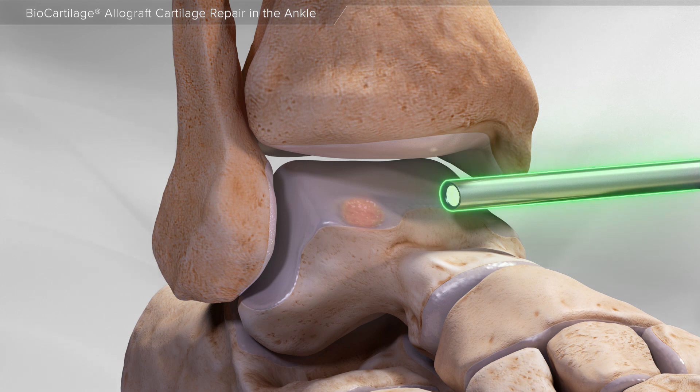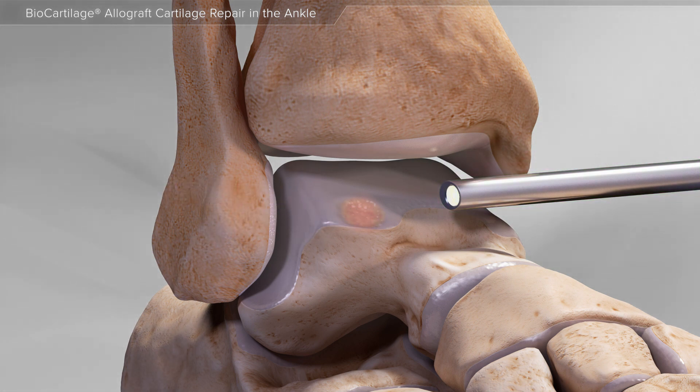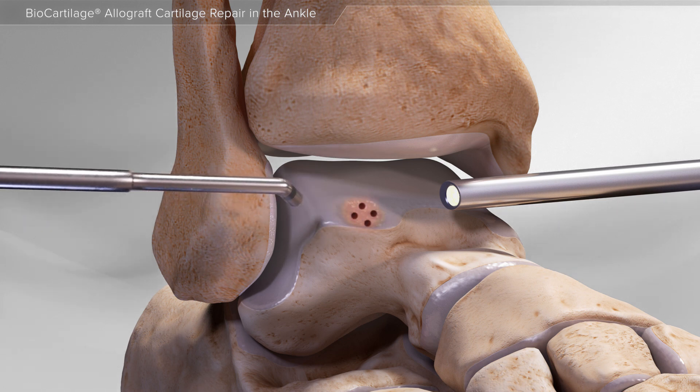First, a camera is inserted into the ankle joint for visualization of the cartilage defect. Next, special instruments are used to remove any loose fragments of cartilage, and small holes are made in the bone to allow blood flow to the defect.